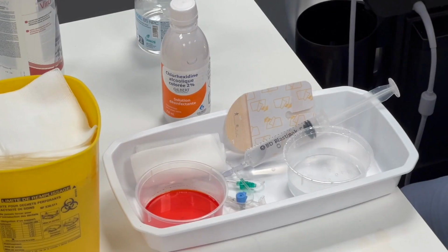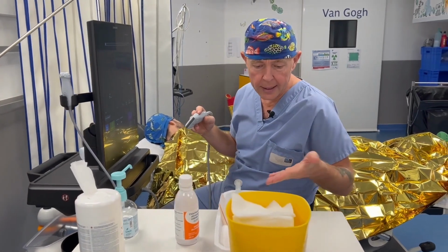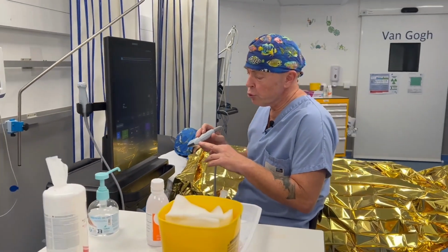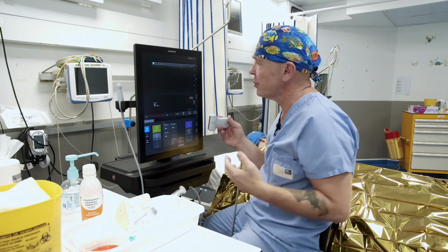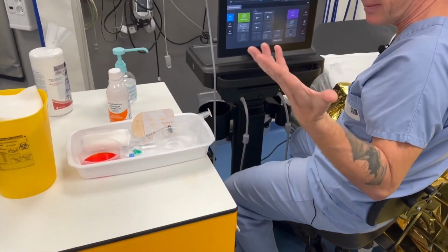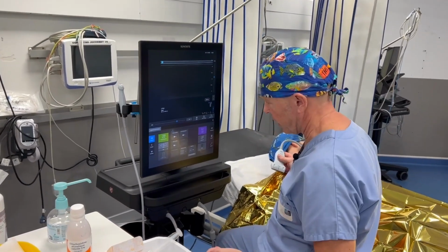Here you observe, I have a cart with all the medications and syringes within easy reach. Here are my syringes, disinfectants, compresses, my syringe thoroughly prepared, and everything else that is necessary. The second thing is to use both hands for the injection. That is very important as well. Personally, I always choose to inject on the side that corresponds to this mark. You can change it, but it's a bit absurd to impose additional constraints on yourself. And I position my right hand on the patient. This method allows my left hand to remain free to hold my syringe, grasp disinfectant, and dispose of my compresses into the waste container, and all those items.